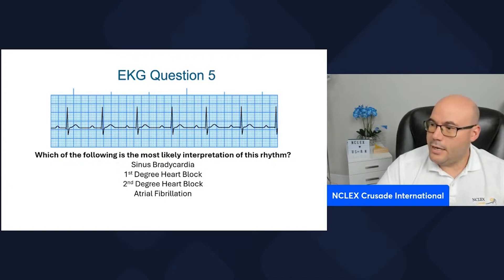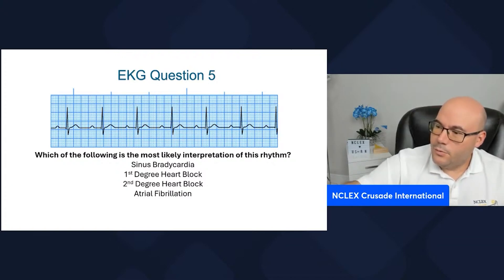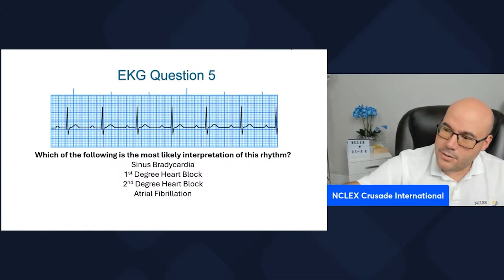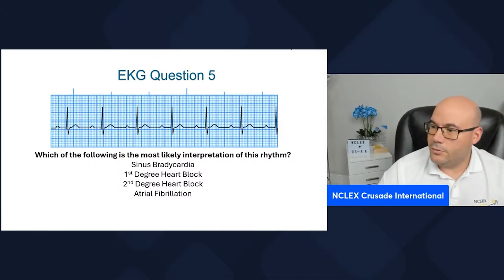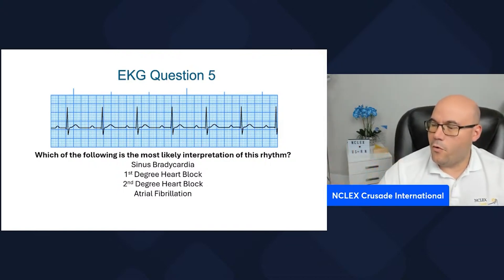So let's see. We have one, two, three big squares, four little squares, and four little squares on the other side. So one, two, three, and four little squares on the left and four little squares on the right.